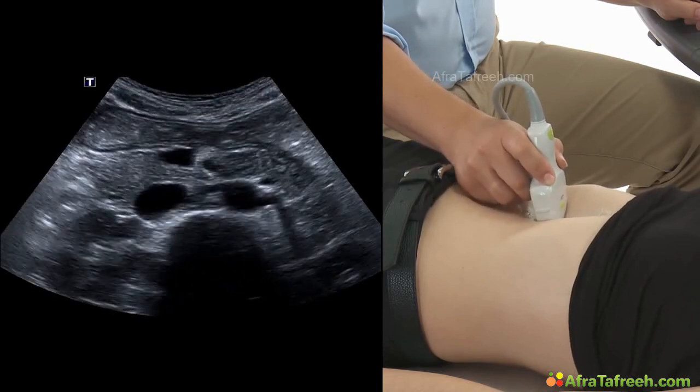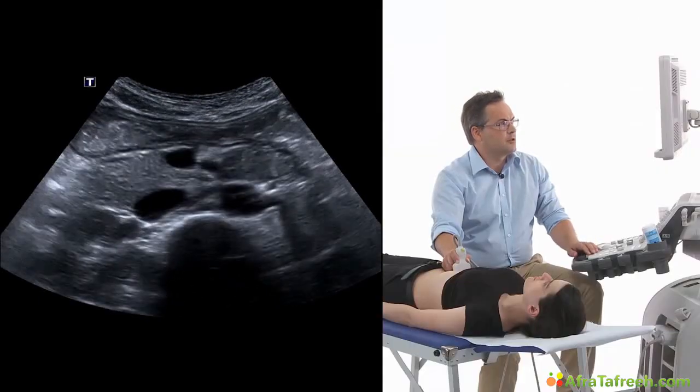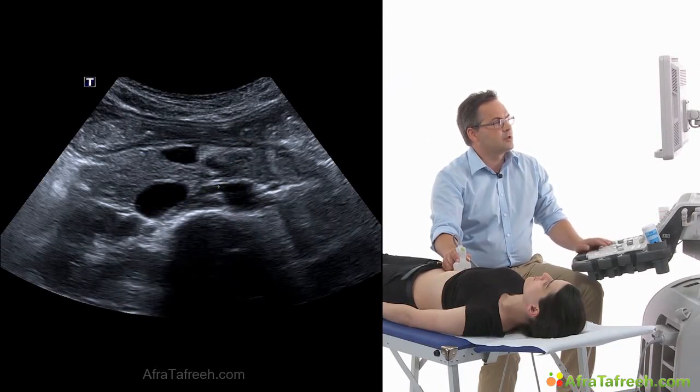And slightly caudally, we see these two origins of arteries over here on the right side and over here on the left side. These are the origins of the right renal artery and the left renal artery.